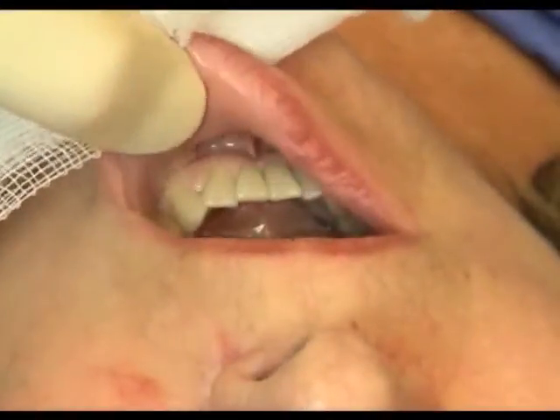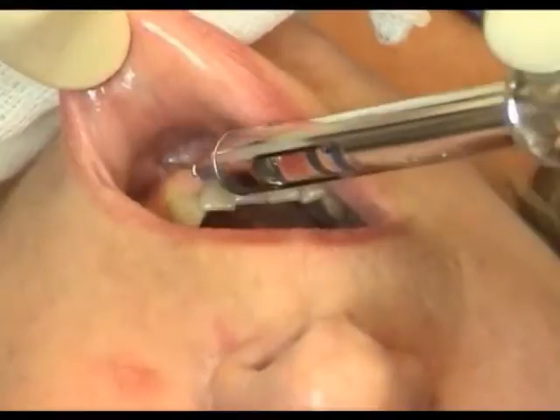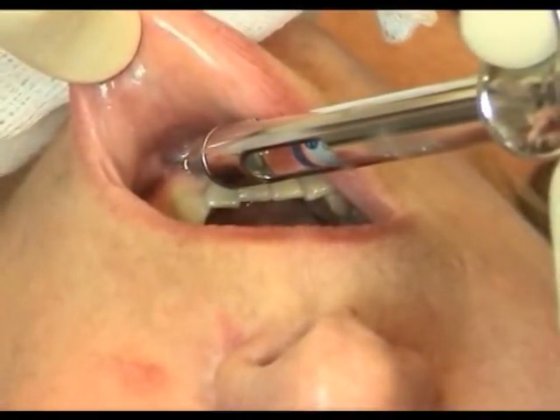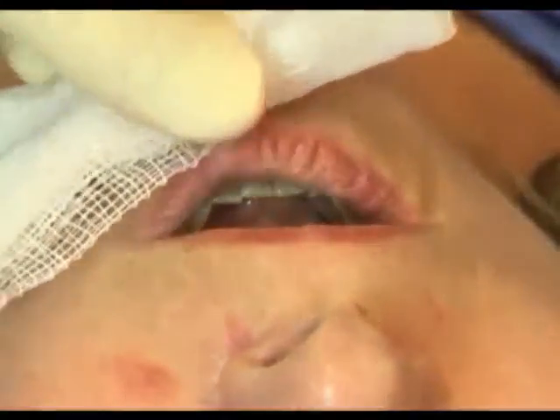Here, the needle is inserted between the first and second premolar. Topical anesthesia may be applied at this junction, and then the needle is inserted through there and down approximately 1 centimeter to the root of the mental nerve. Approximately 2 milliliters of a 1 to 2% lidocaine solution are injected.